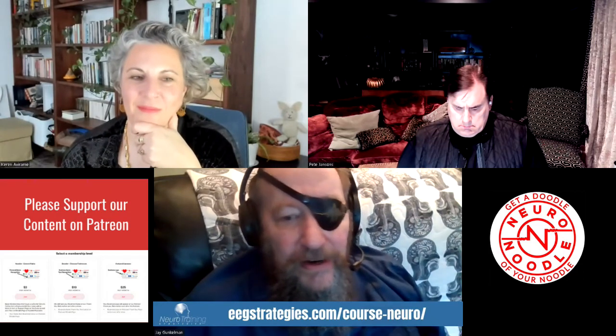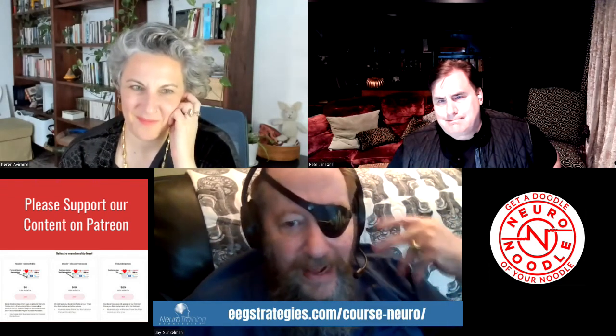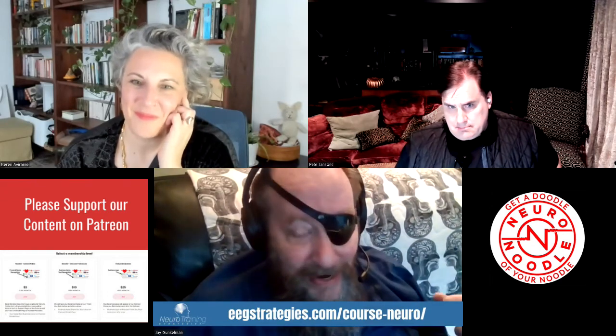How does that start? If you're wide awake, you've got alpha in the back of your head, eyes closed. But as you start to get a little less vigilant and attentive, and you can't control your attention quite as well, the alpha goes into the front as well. And that's from an A1 to an A2 stage. And then A3, alpha is dominant up front, bigger than the alpha in the back of the head. And at that point, you're not as vigilant as you were when you had alpha just in the back of your head.